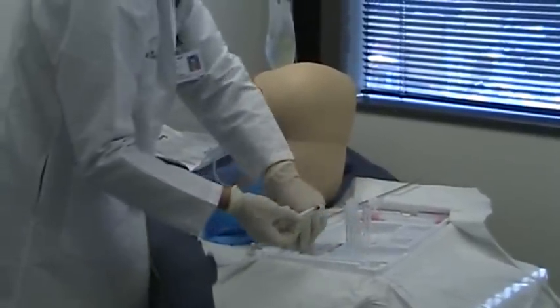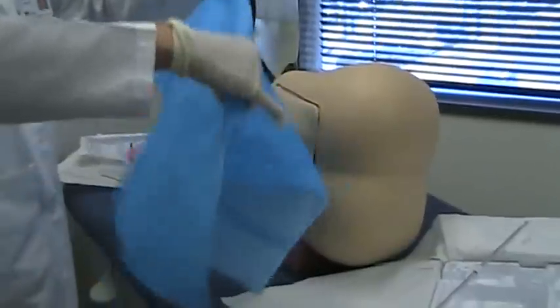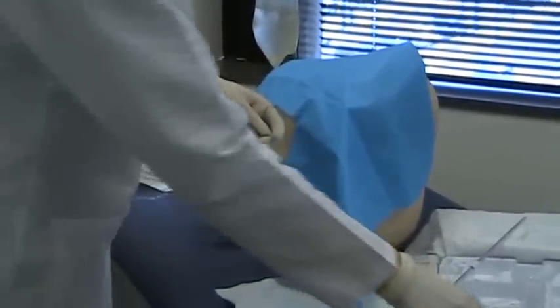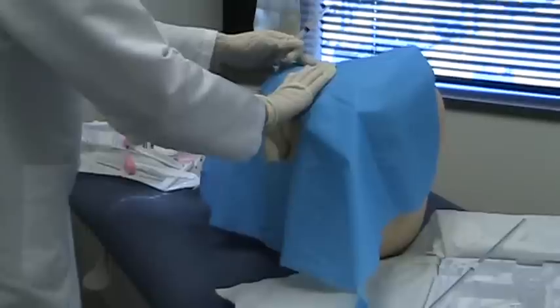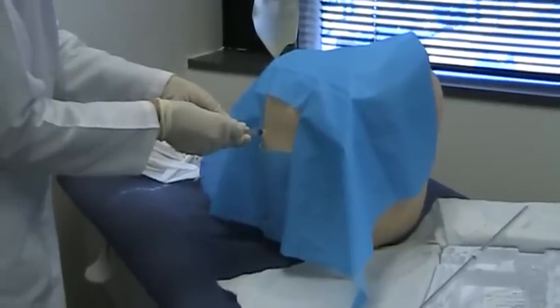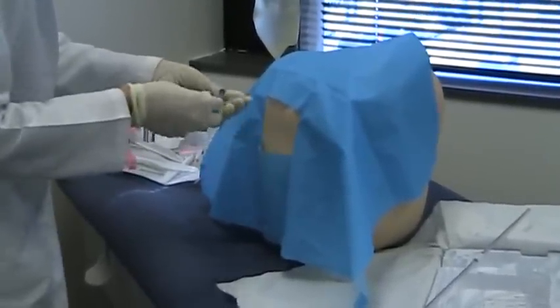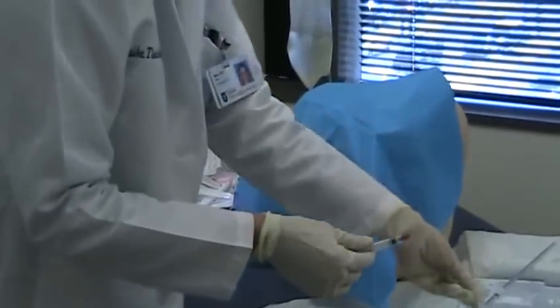The local anesthetic is ready, and I have an extra one on the side in case I need it. We recheck our landmarks to confirm the right position and that the patient remains in the same position. We then start injecting the local anesthetic — first a small wheal. We always check that no blood is coming back before injecting.